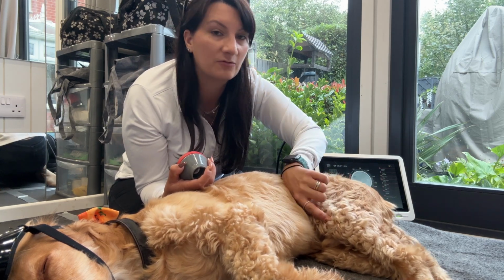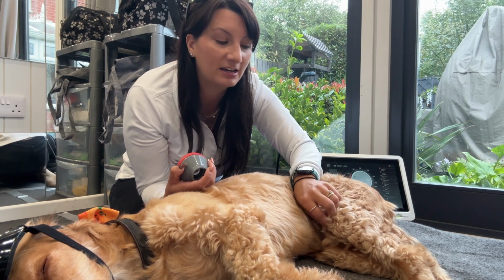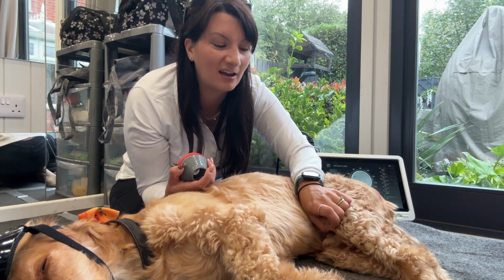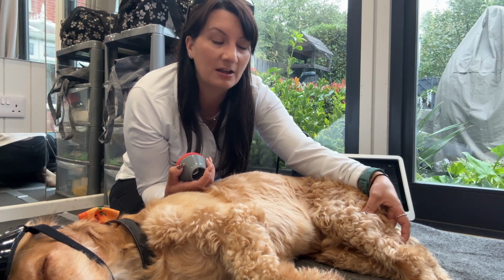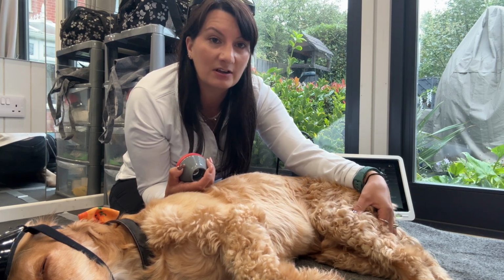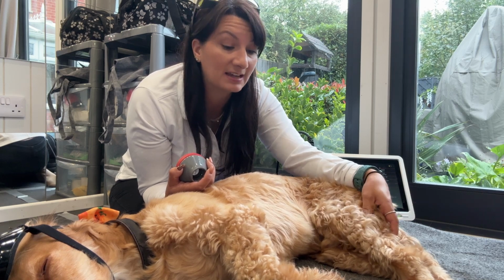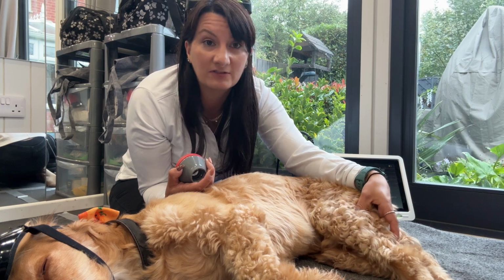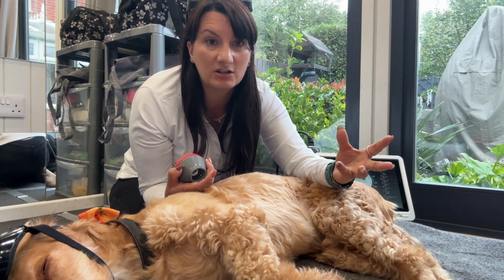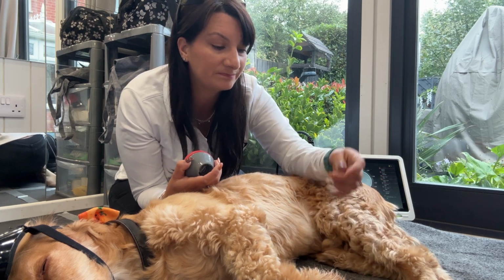So if we're trying to go through the stifle, if we're going cranial, there's quite a lot of bone and dense tissue here. Whereas if we go through caudally, there's obviously more tissue, but a lot of those are softer tissues. So sometimes you'll get better access to that joint space going in from a different angle. So always try to treat 360 degrees around a joint space as best as possible whenever you can.